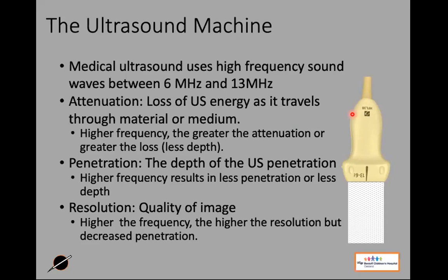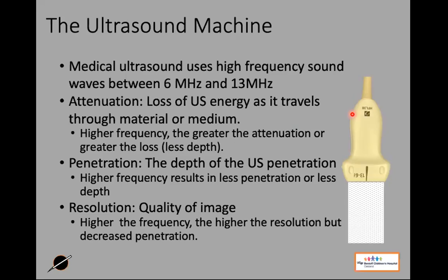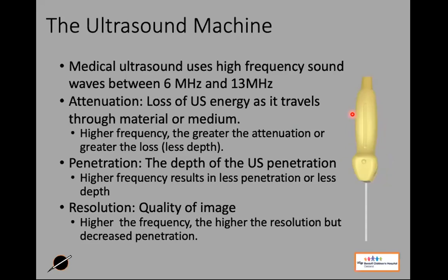If we rotate our probe, so this is the side view of that beam of sound that's traveling through. So in one direction, we've got a nice wide beam. In the other one, we've got a nice narrow beam. Okay, so I want you to be thinking about that when you're moving your probe. It looks like you got this nice big picture, but if you were to rotate that probe, we're only catching like that much tissue in our beam.